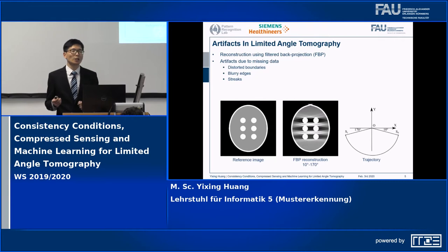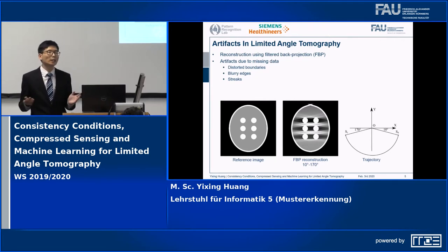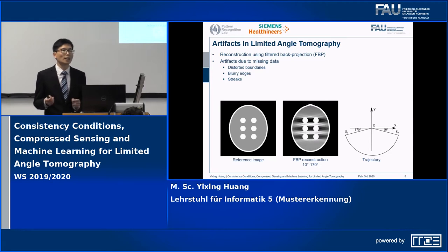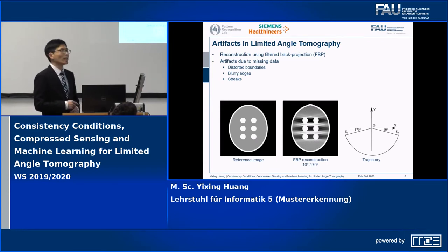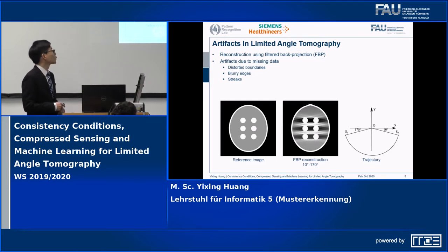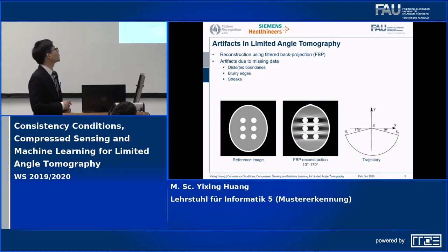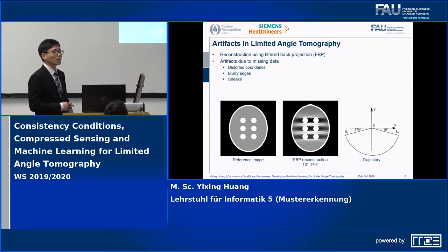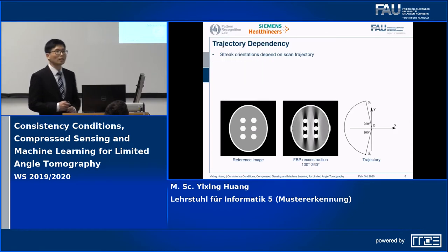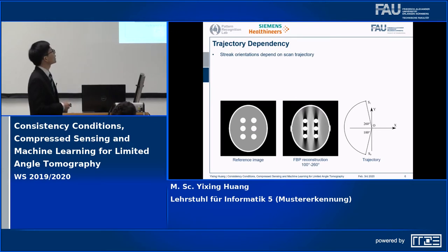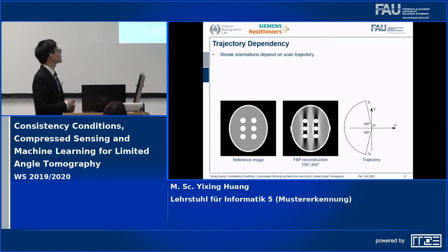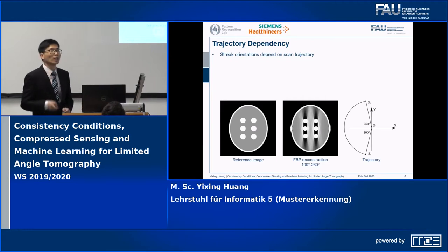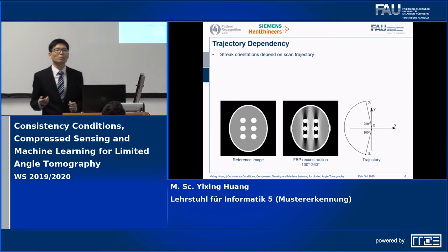In CT, filtered back projection is the standard image reconstruction technique. However, in limited angle tomography, due to missing data, artifacts will occur. For example, this is a reference image, and this is a 160-degree FBP reconstruction with the trajectory from 10 degrees to 170 degrees. Here we can see the boundary is distorted, many edges are blurred, and there are many horizontal large streaks. The orientations of these streaks are highly dependent on the scan trajectory. For example, if we switch to a trajectory from 100 degrees to 260 degrees, then the streak orientations are almost vertical instead of horizontal. This is called the trajectory dependency property of limited angle tomography.